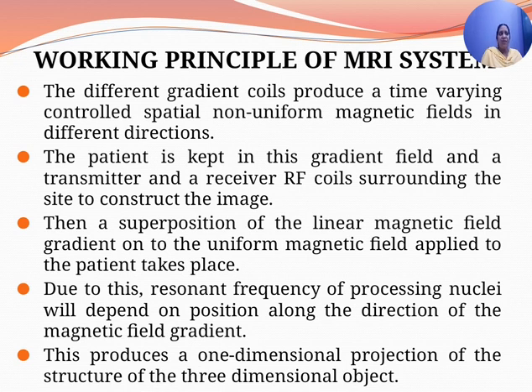Then the radio frequency coils transmit radio frequency waves into the patient's body. What do the radio frequency coils do? They transmit radio frequency waves into the patient's body. There are different coils located inside the MRI scanner to transmit the waves into different body parts.